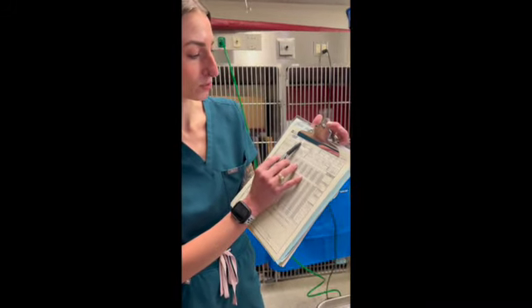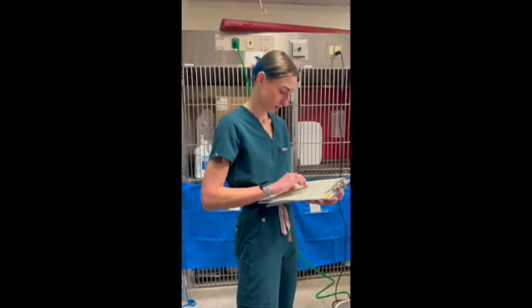We are just monitoring our feline patient, Jack. He's just here for extractions. He is already under anesthesia, so we're just going to make sure that we write down his vitals, and we're going to be recording those every 5 minutes.